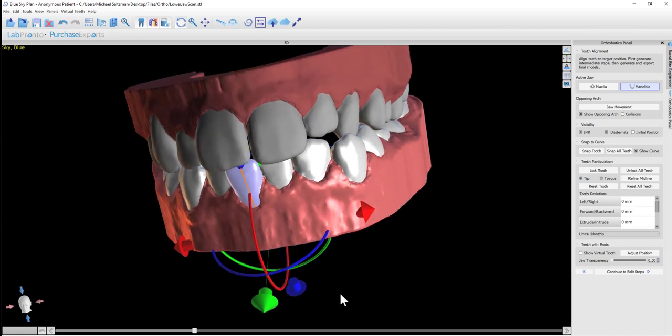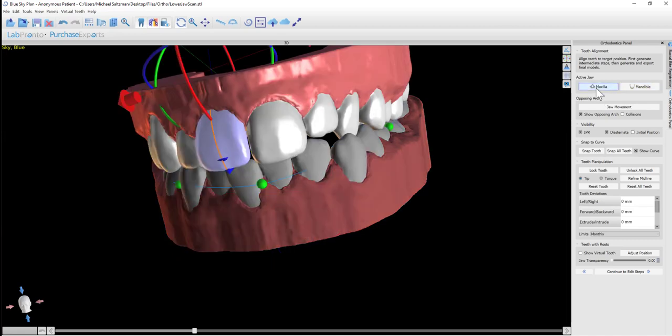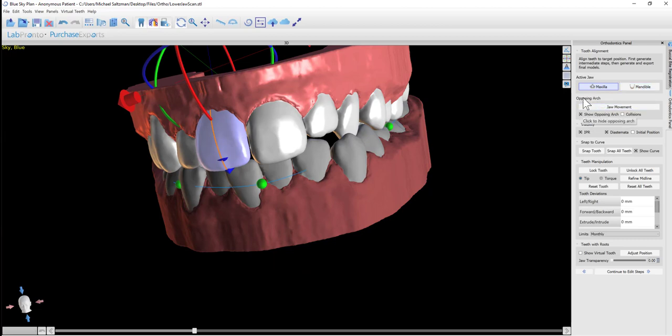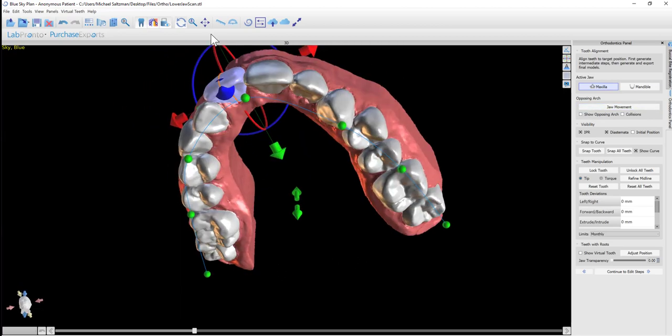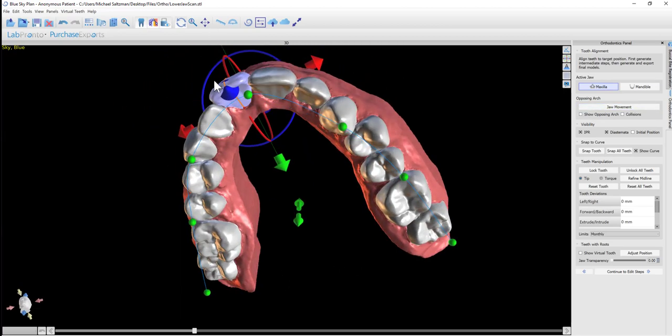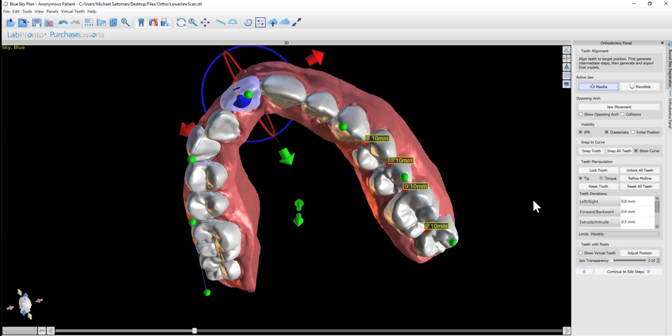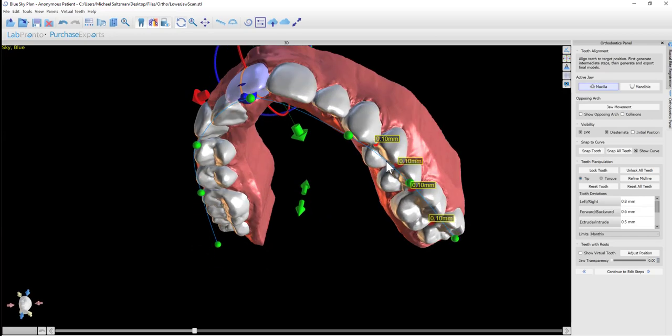Before manipulating individual teeth, we have the ability to select the relevant jaw where we'd like to start off with, maxilla or mandible. We have the option to show opposing arch, so if I select the maxilla, the opposing arch is the mandible. Now we have a curve that shows up above the teeth, and we can click snap all teeth. With a single click, the software will give us a proposed tooth positioning to start with.